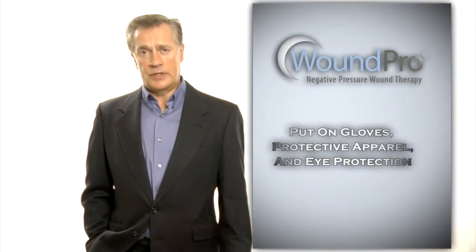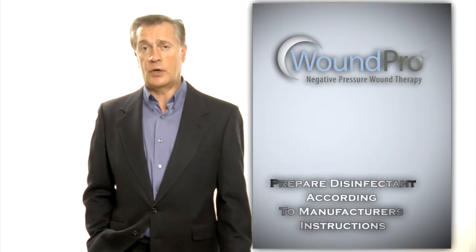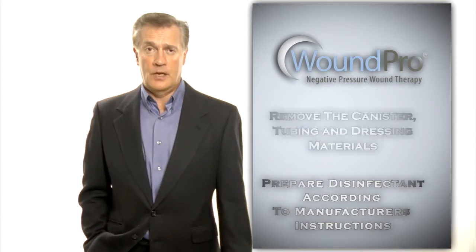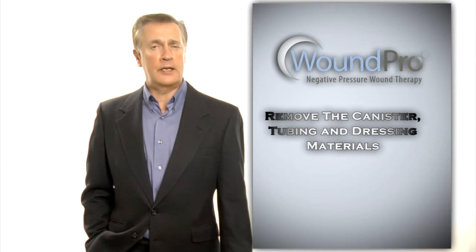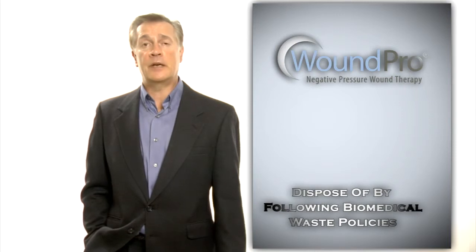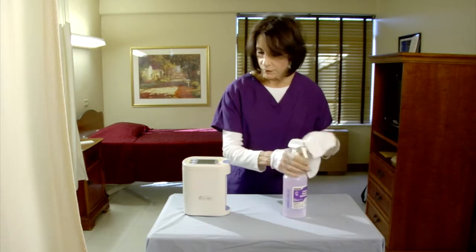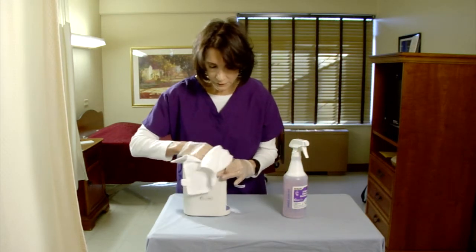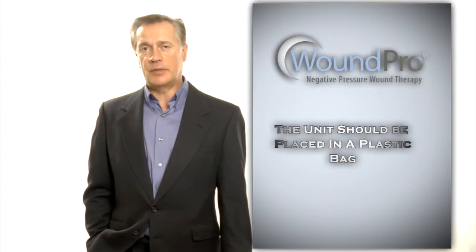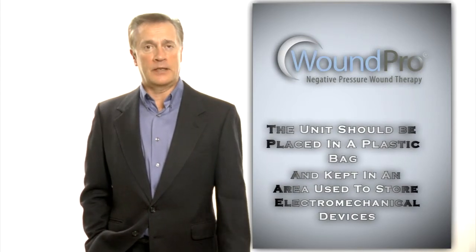Put on gloves, protective apparel, and eye protection. Prepare disinfectant solution according to the disinfectant manufacturer's instructions for correct use. Remove the canister, tubing, and any dressing material still connected to the unit. Dispose of them by following your biomedical waste disposal policies. Using the disinfectant solution prepared, thoroughly wipe down the outside of the control unit. Allow to air dry. After disinfecting the unit, it should be placed in a plastic bag and stored in a clean area used to store electromechanical medical devices.